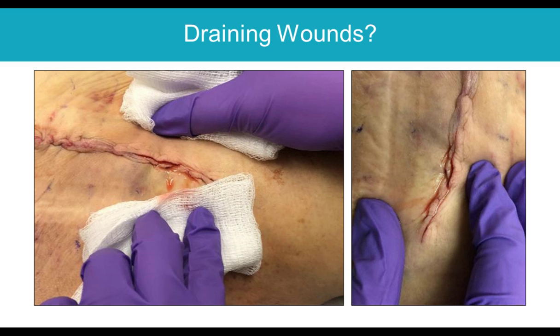Number one, can you use this on a draining wound on the floor or in the office in a patient who presents with late drainage after surgery? In short, it's suboptimal to have not done it in the operating room, but assuming you didn't do it in the operating room and you have this, I think it's still quite a bit better than just watching the incision drain.